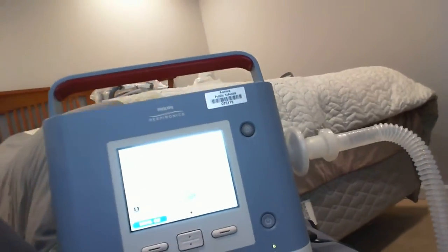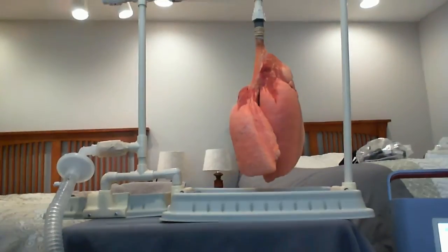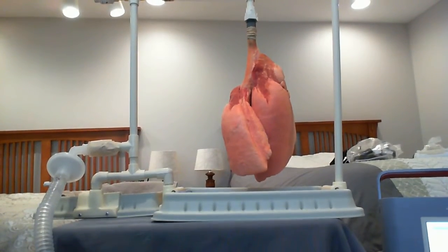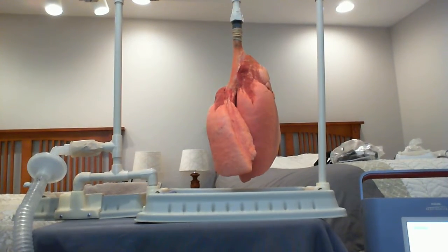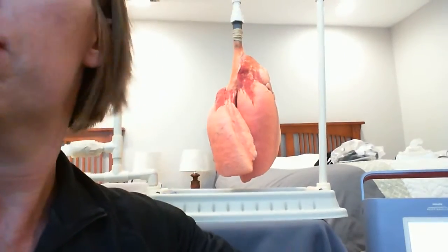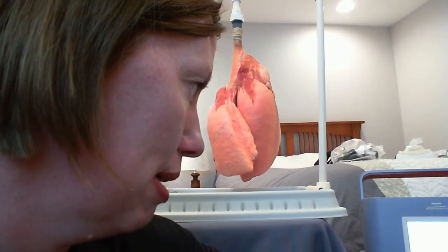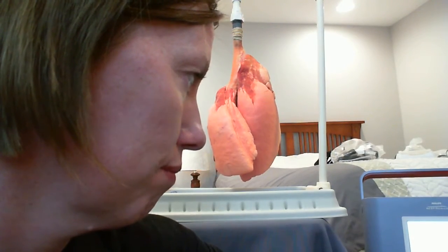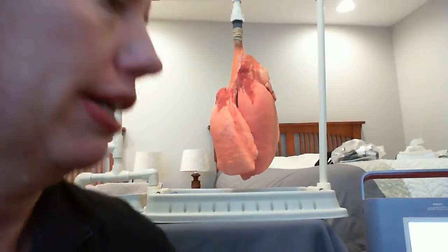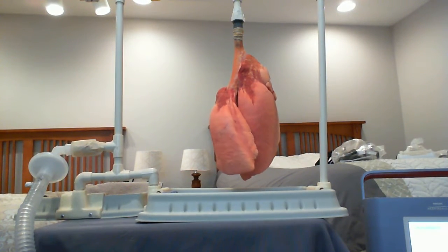Okay, and notice we're going to inflate the lungs. So we have a rate of 25, a high pressure of 25, and a low pressure of 12. And just for some examples, I'll show you the importance of PEEP. Here in my settings, I will turn my PEEP all the way down to the lowest I can get, which is 4. Okay, so now you can see how much more de-recruited the lungs are.